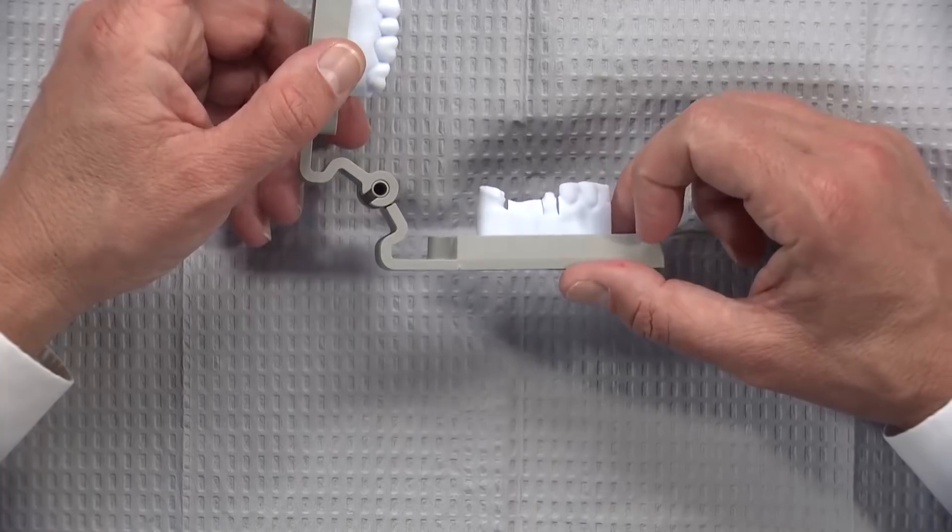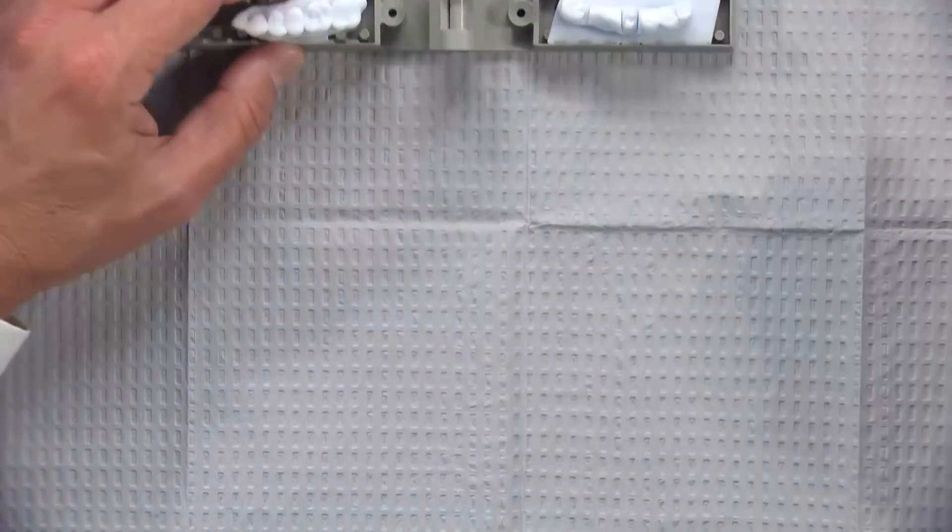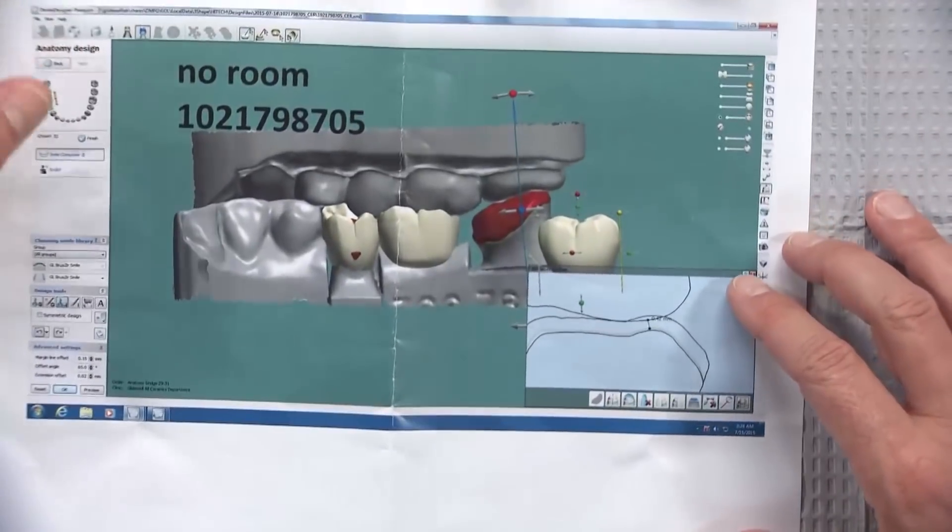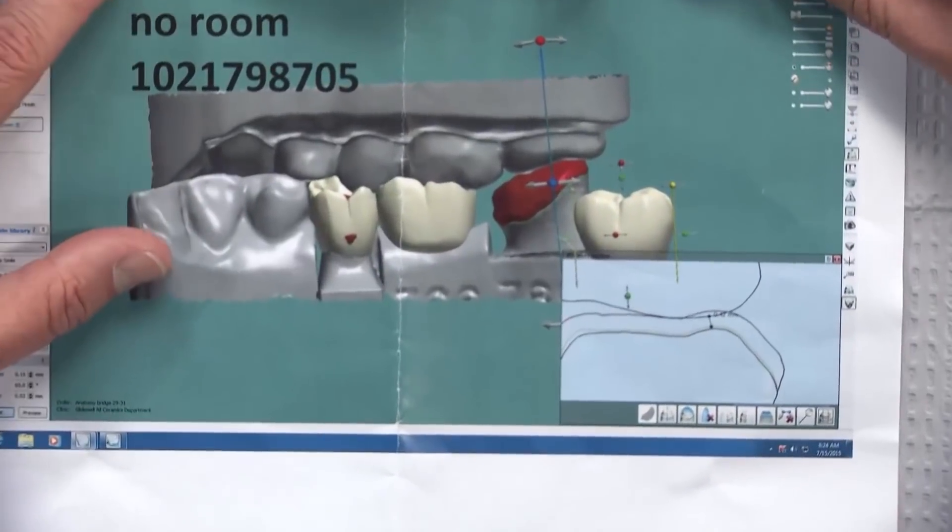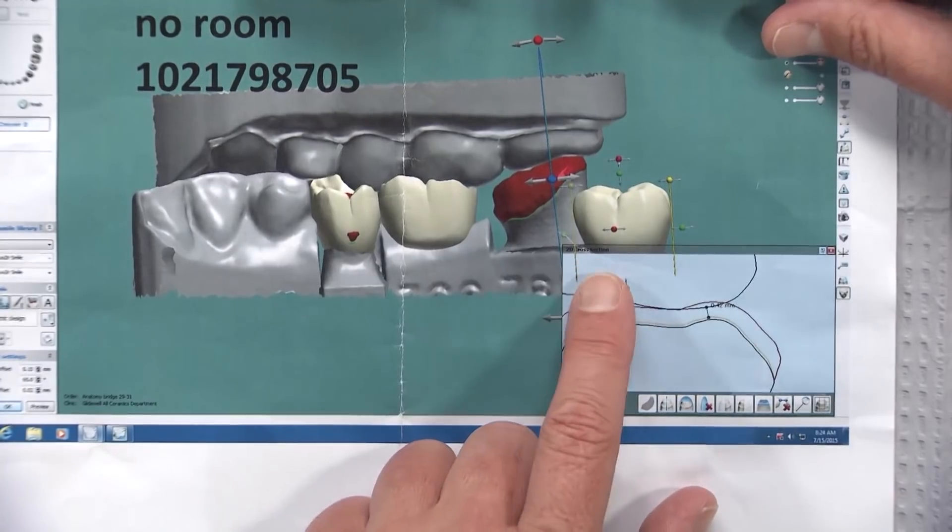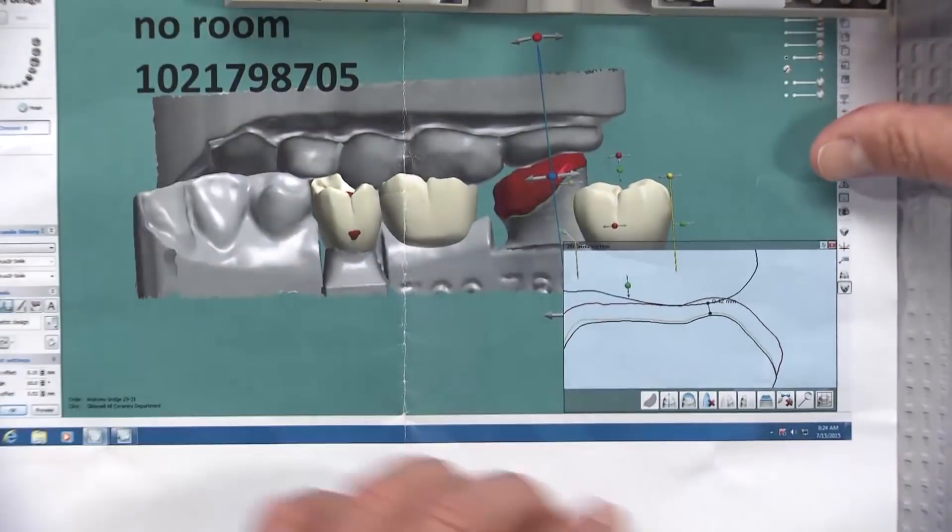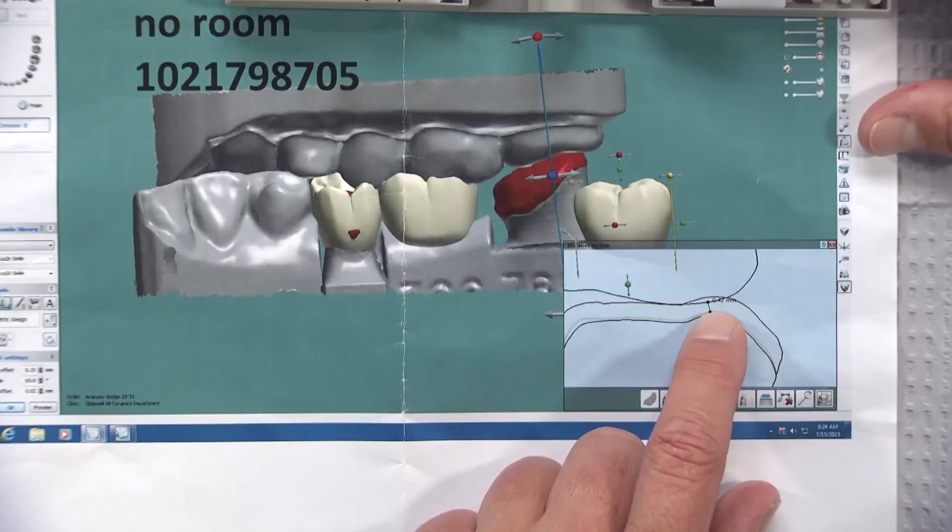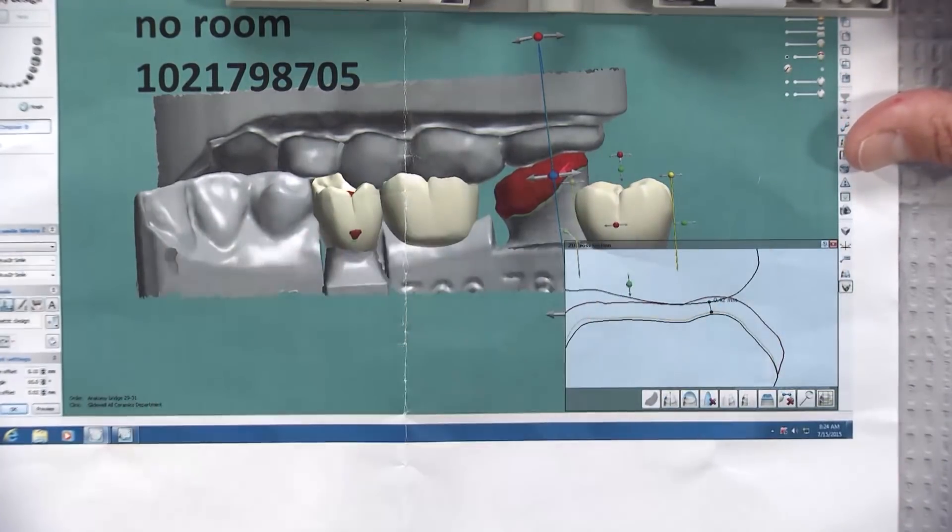The interesting thing here though is that when we took the doctor's digital impression which we received in addition to the physical bridge that came in, we realized that there was not enough room here for this bridge, specifically on the most distal abutment. On this tooth right here when we measured it, we get 0.42 millimeters.